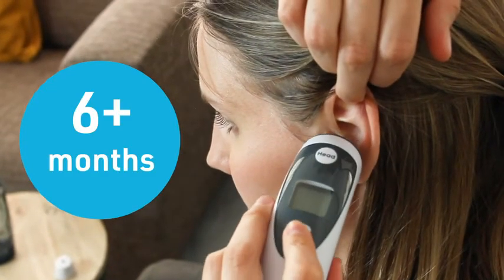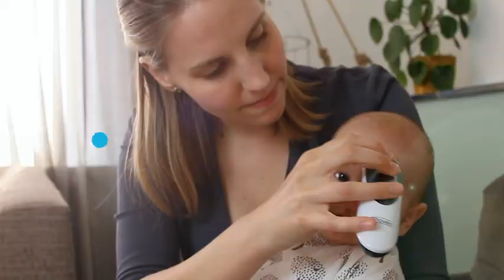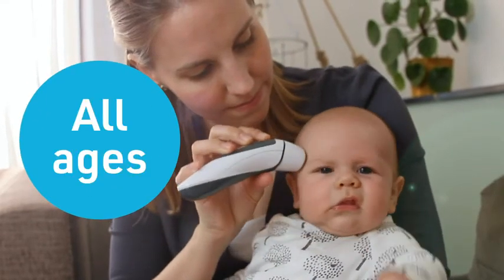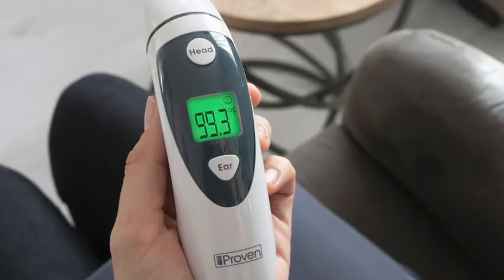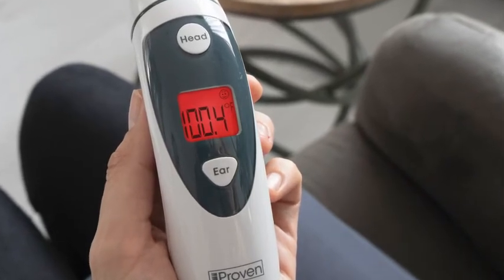Keep in mind that the ear mode of the thermometer is only suitable for children of 6 months and older. The forehead mode is suitable for all ages. The thermometer's built-in fever alarm system turns red and beeps consecutively when detecting a fever.